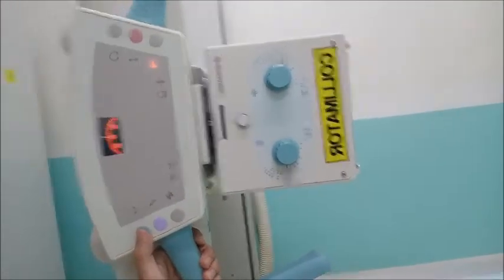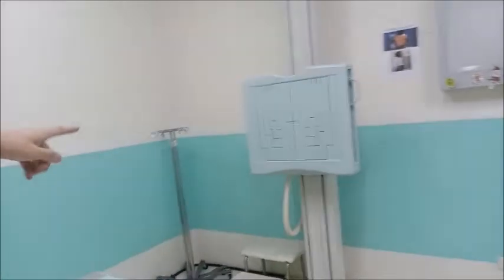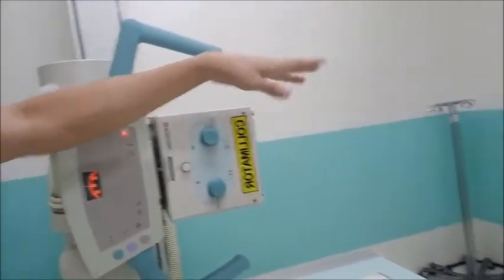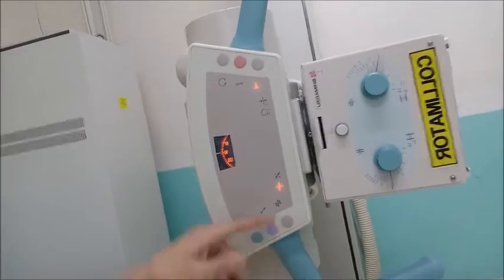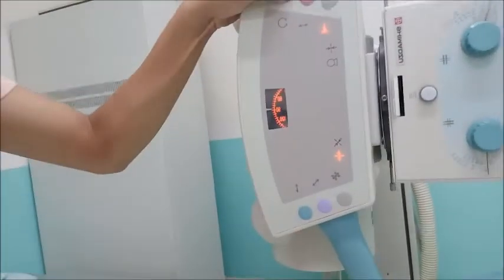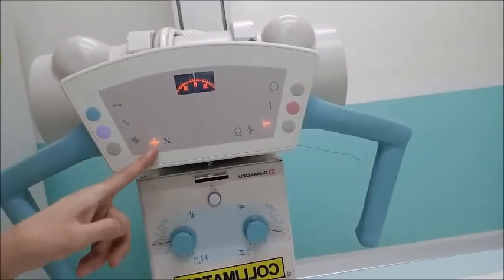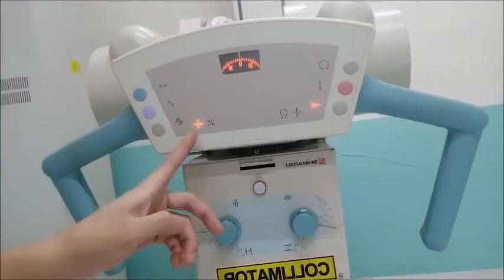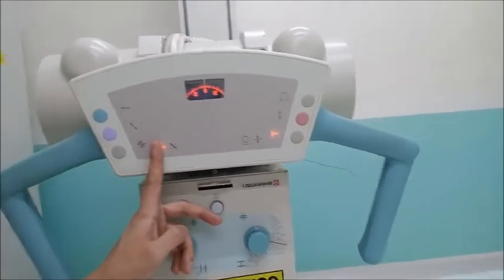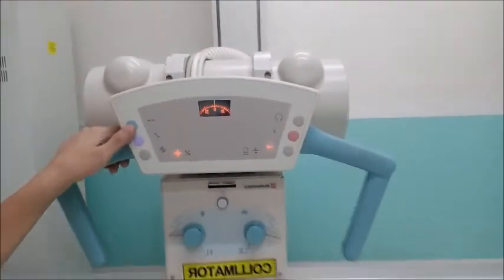Okay, like for example, chest PA. For the chest PA exam, the required minimum distance from the IR to the source should be approximately 72 inches. You can move it. So that means this arrow, the vertical portion, the center of the X-ray tube, is approximately 72 inches from here, towards the IR.